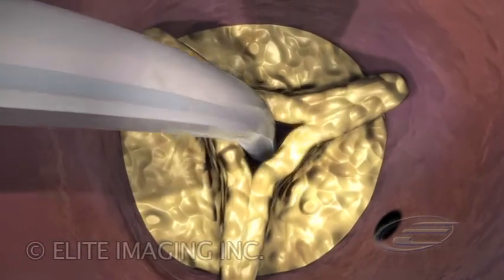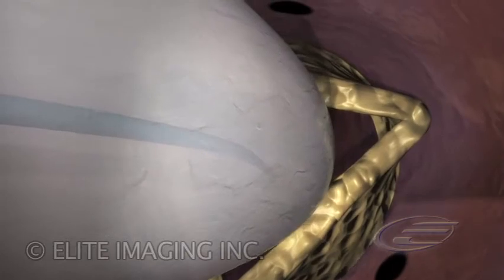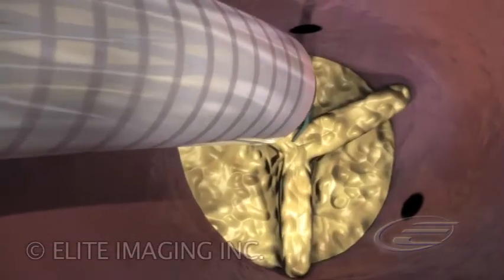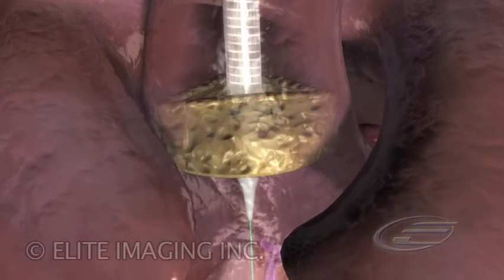In the case of aortic stenosis, a single inflation of a valvuloplasty balloon is performed before the implantation. The delivery system is advanced over the guide wire, retrograde, from the femoral artery up to the failing native aortic valve and is positioned in the aortic valve annulus.